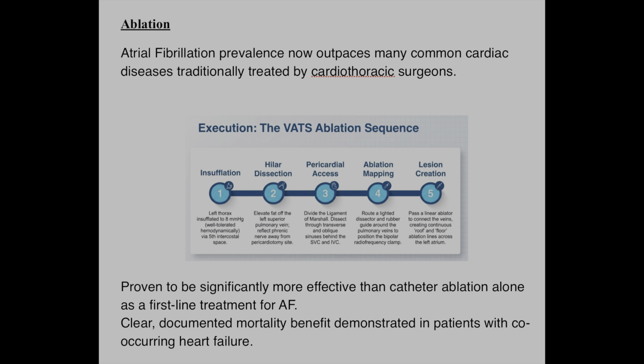Involvement of the ablation methods. It is mainly used in the treatment of atrial fibrillation. Atrial fibrillation prevalence now outpaces many common cardiac diseases traditionally treated by cardiothoracic surgeons.